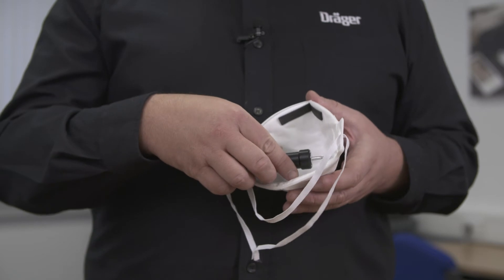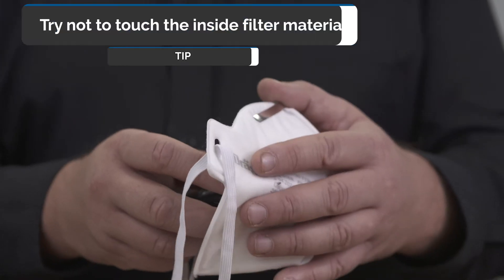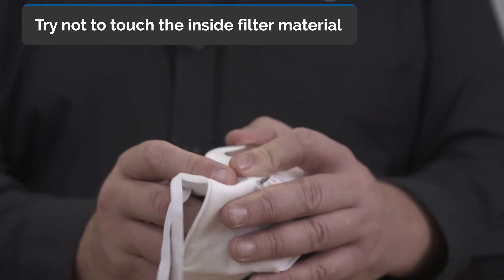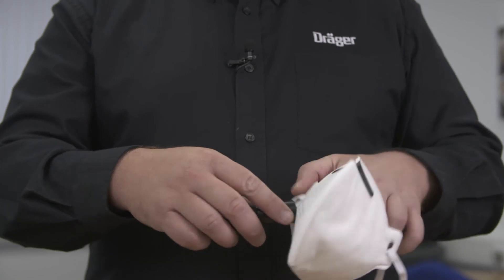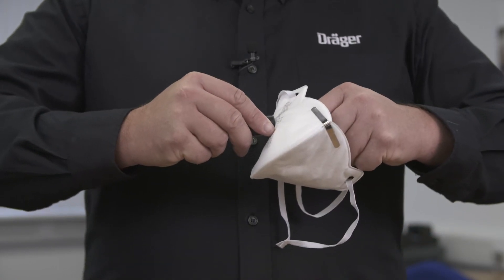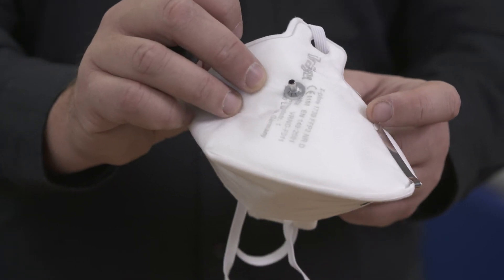Take the probe to the inside of the mask and penetrate from inside to outside of the mask, being careful not to pierce your finger. Then apply your locking nut to the outside of the mask and push both probing tools together. This will ensure the probe is securely fitted to the mask.